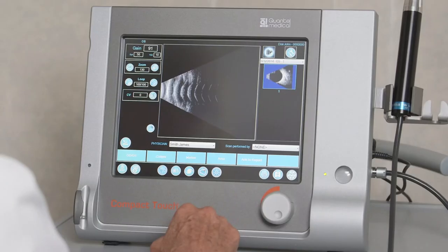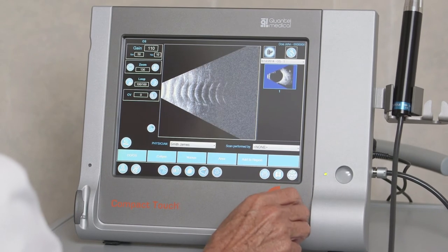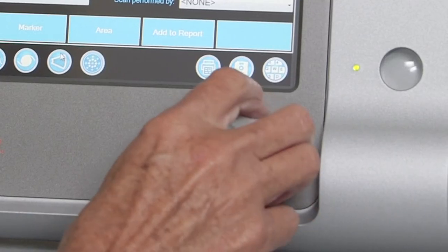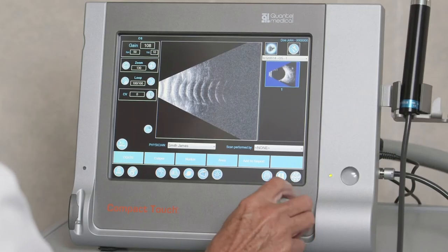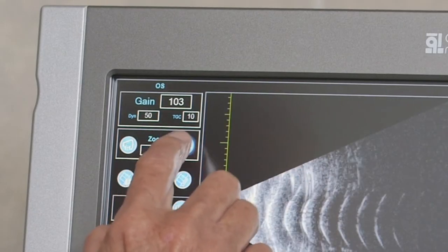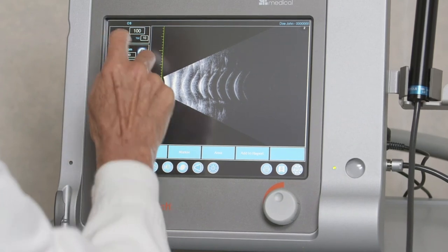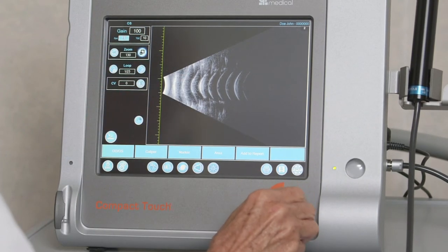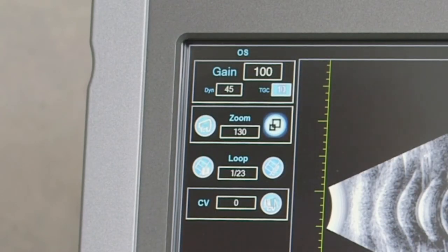Selecting the B-scan icon activates the B-scan function. To the left of the image area is the parameter field, where gain, dynamic, TGC, and zoom are shown and can be modified by touching each field and using the grey knob or the virtual keyboard. Selecting the full screen icon on the right side of the zoom field allows the examiner to view an image in full screen mode. Parameters such as gain and TGC can be adjusted by turning the front knob or by clicking in the gain field and using the scroll wheel.